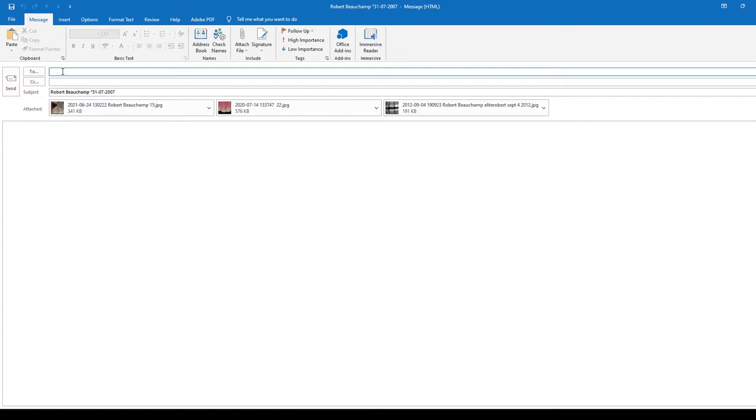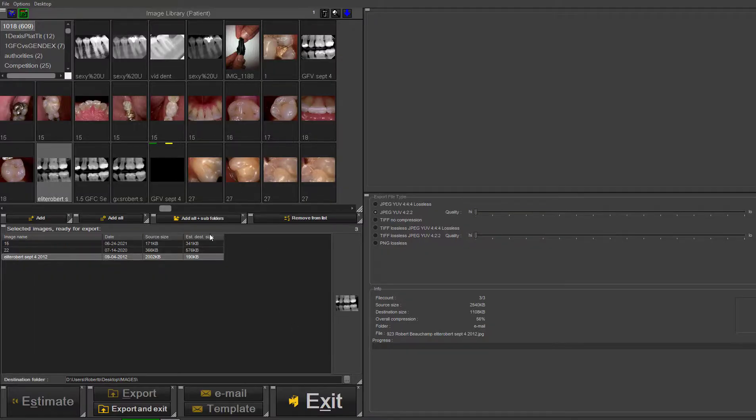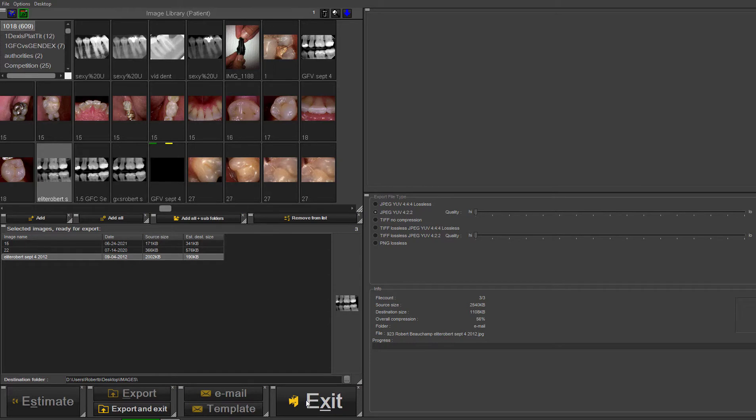Once you're finished, the images will be exported and you'll go back. The window will still be open. Just exit to go back to your main screen and that's it.